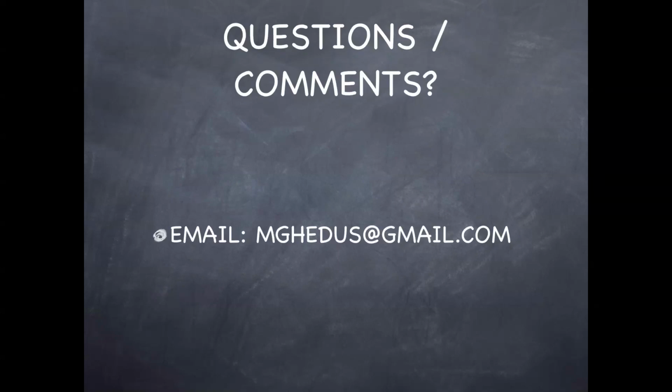So the point of these two cases was to show how you can do an ultrasound of both the heart and lungs in patients who are short of breath. You can also do this in chest pain. It often will give you a lot of information that really helps in diagnosing what's going on. It will limit unnecessary tests and really point you in the right direction, because there are a lot of 80-year-olds we see who are short of breath, and it could be anything from a PE to pneumonia.